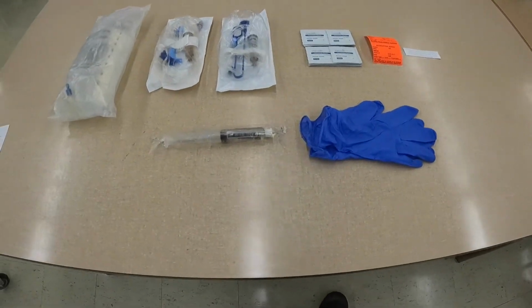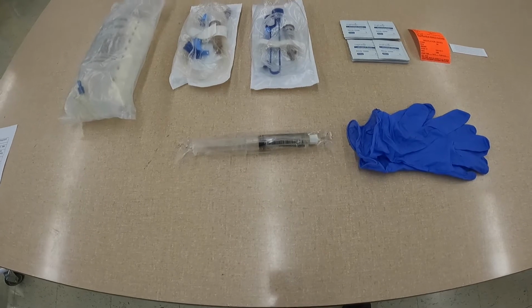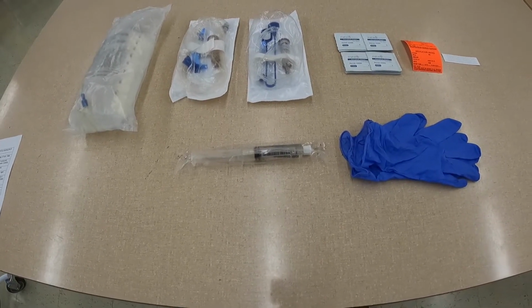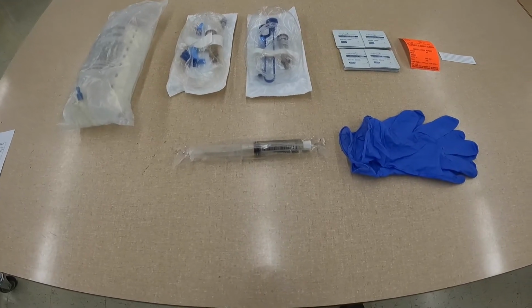You also need gloves, and then of course you also need a saline flush, which we'll use to make sure that we have an IV that is patent before we hook up the tubing.